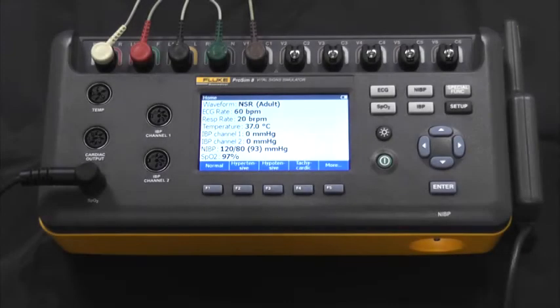Hello, we're here today to introduce the Fluke Biomedical ProSim 8 Vital Sign Simulator. This is a full-featured, compact, portable simulator used to measure the performance of patient monitors.